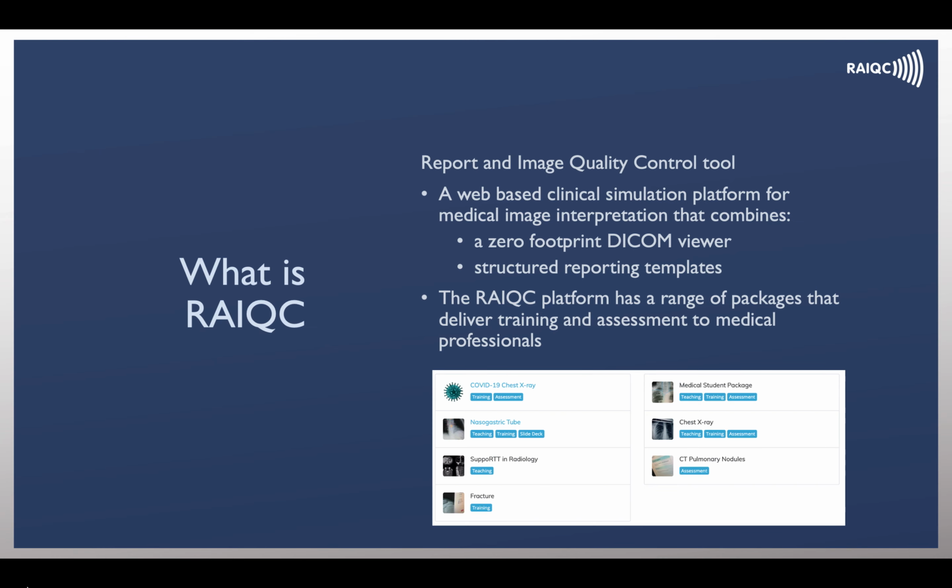So, what is RAIQC? Well, it's the Report and Image Quality Control tool. As I mentioned, it's a web-based clinical simulation platform for medical image interpretation. It combines a zero-footprint DICOM viewer with structured reporting templates. The platform has a range of packages that deliver training and assessment to medical professionals.